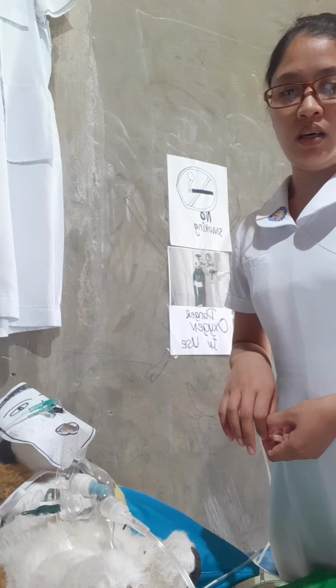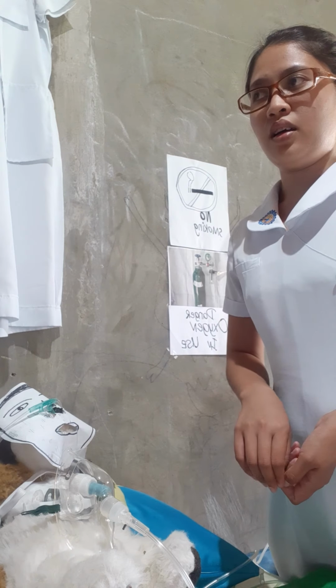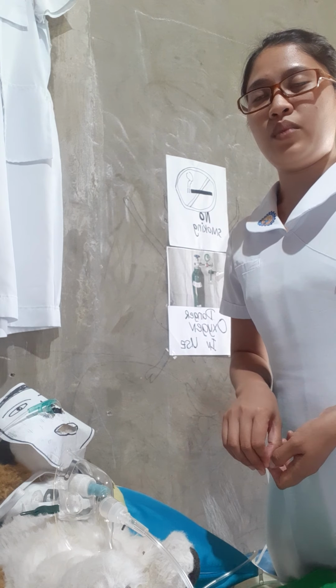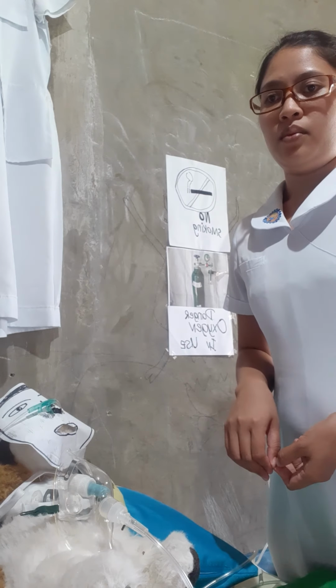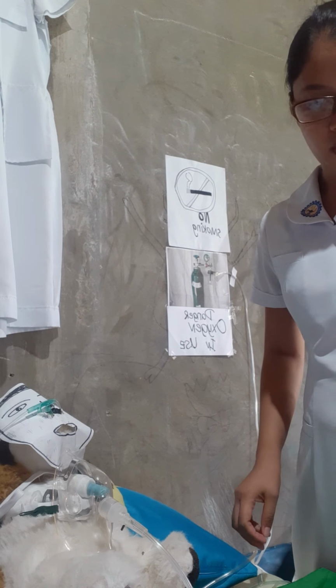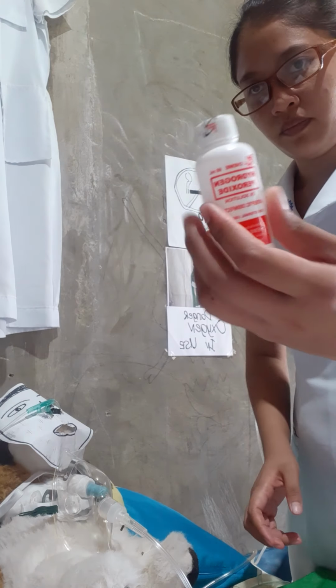But if not complete in the kit, we need to open 3 sterile basins. Then next, we need to fill the first basin with 0.5 hydrogen peroxide.